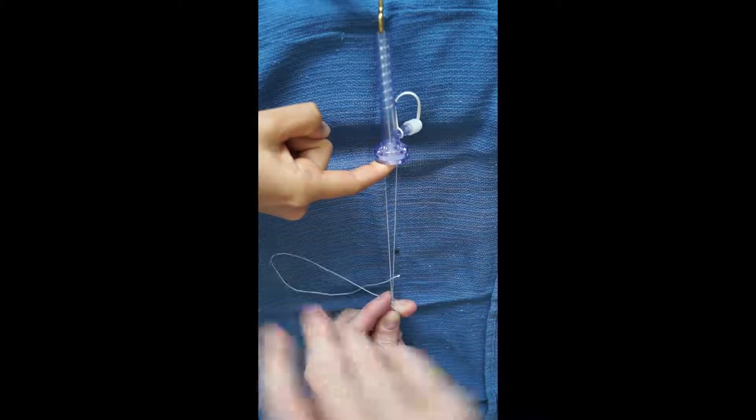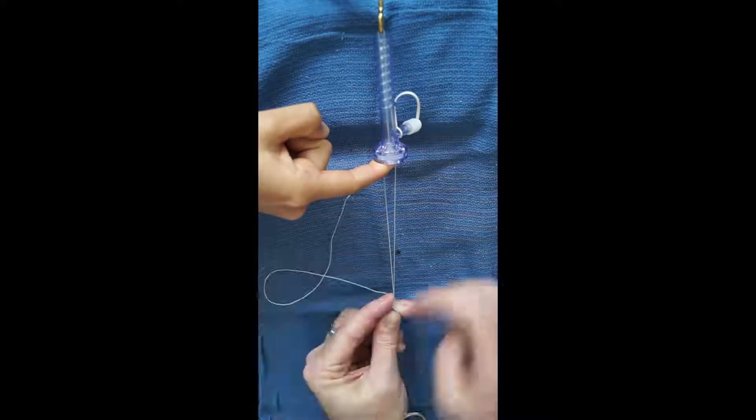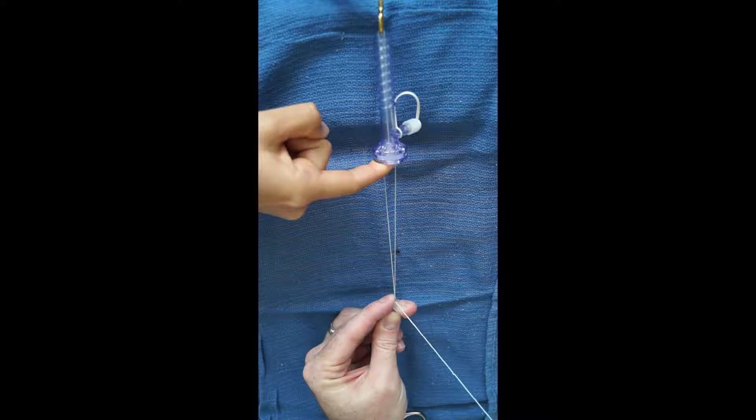Again, it is very important to keep the knot dressed with the post hand index finger and not allow each loop to become entangled with each other. This would prematurely lock the knot and not allow it to slide.